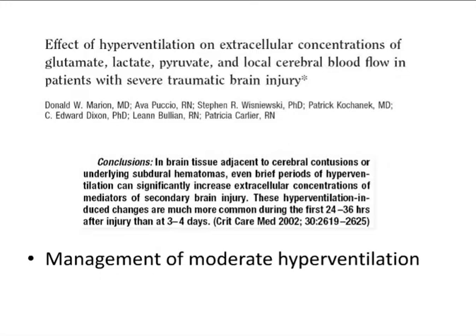And again, we have talked about vasoreactivity, but also CO2 reactivity, and this paper is a demonstration where if you reduce PCO2 and you hyperventilate your patients too much, you can see some patterns of energy dysfunction. So you can use this tool in addition to the other tools we have described.